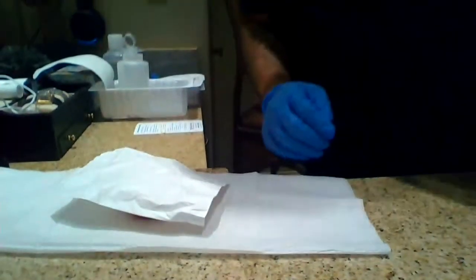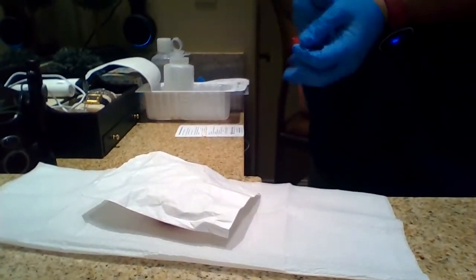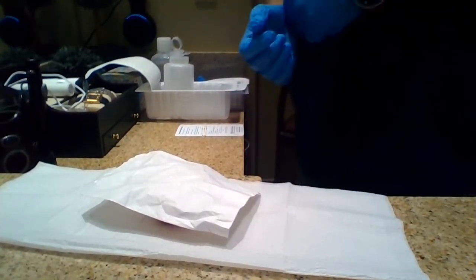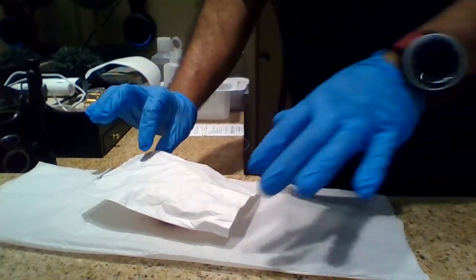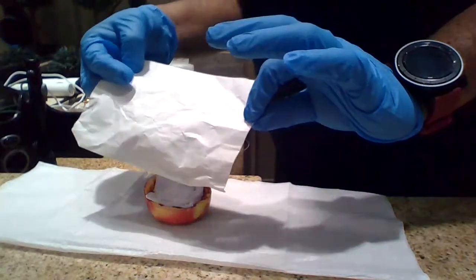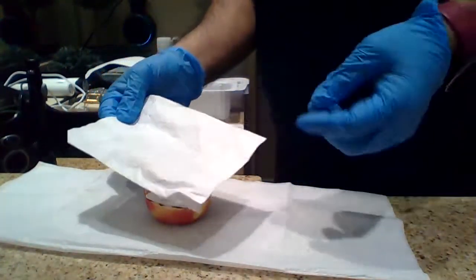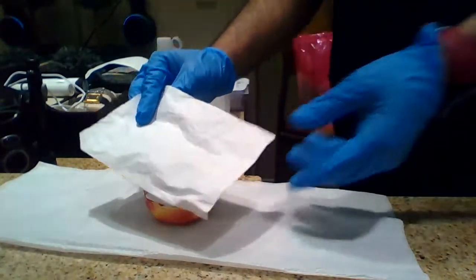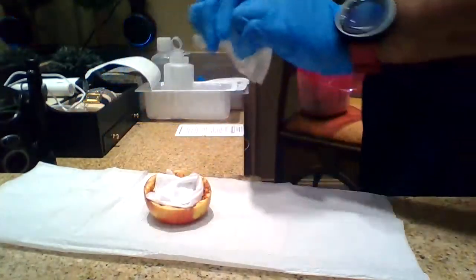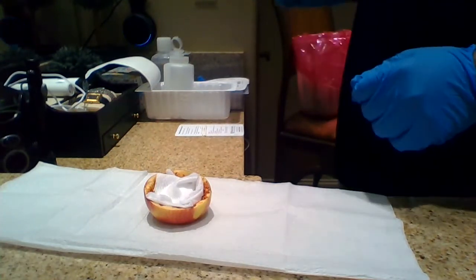So when we assess, we remove the old packing. When we remove the old packing, it should say the date, time, and initials. So when we put the packing back on, we do that. So remove the old packing, we just get it, dump it right in the bag. I hope you can see that.